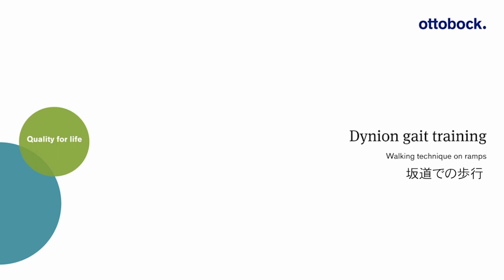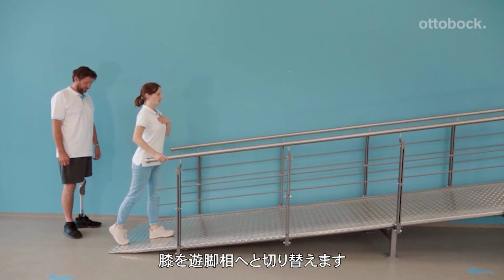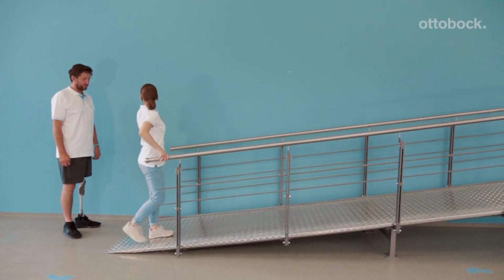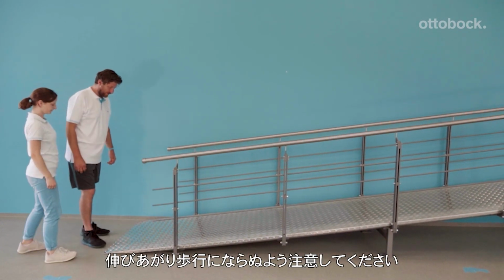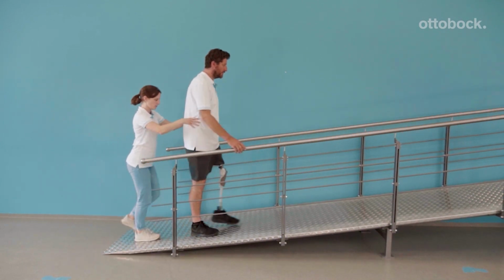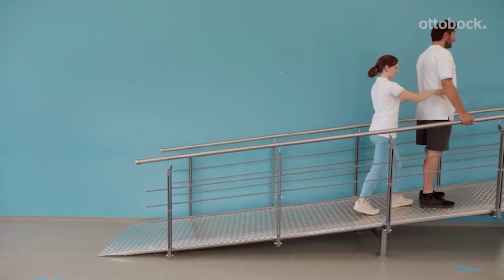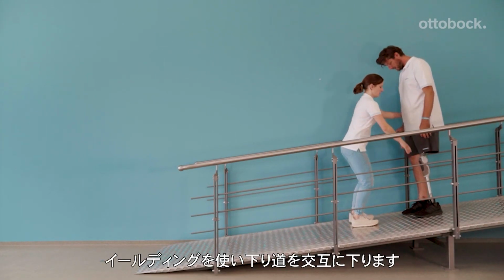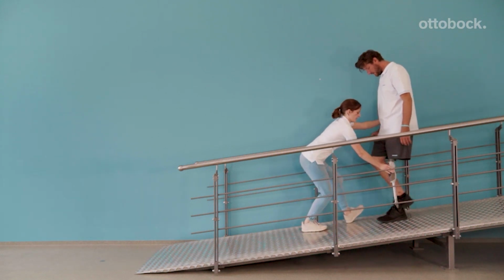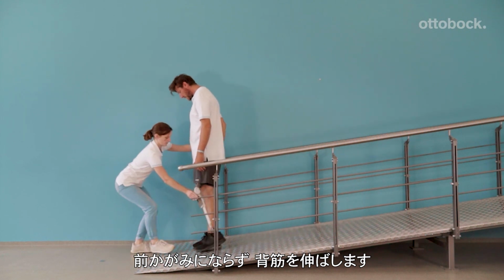When walking uphill, our model makes sure he is initiating swing phase by using the hip flexor muscles. The therapist makes sure he does not circumduct and/or use a hip hiking motion. The yielding technique allows our model to walk down most slopes step over step. His upper body stays upright during the entire movement.